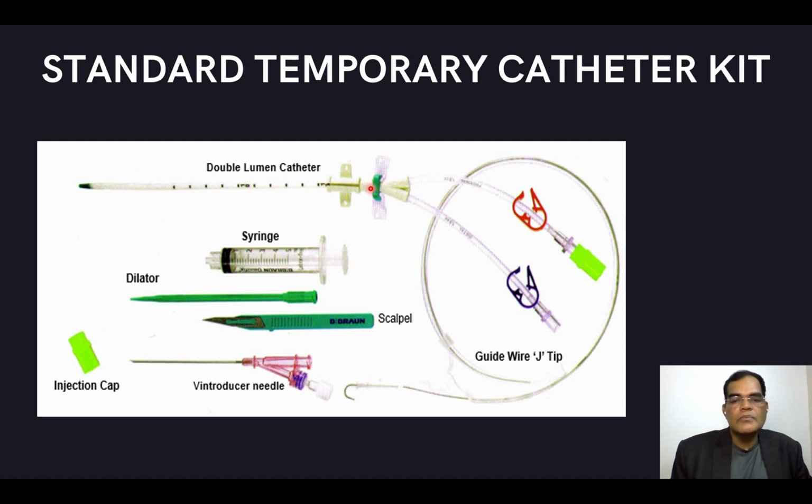Once the catheter is placed, you will see the blood coming out through both the limbs. Then we need to flush it with normal saline, and proper heparinization is required to avoid clotting. After that, we can anchor the catheter, because the wing of the catheter contains an anchoring portion where you can suture it over the subcutaneous area so that the catheter will be stabilized.